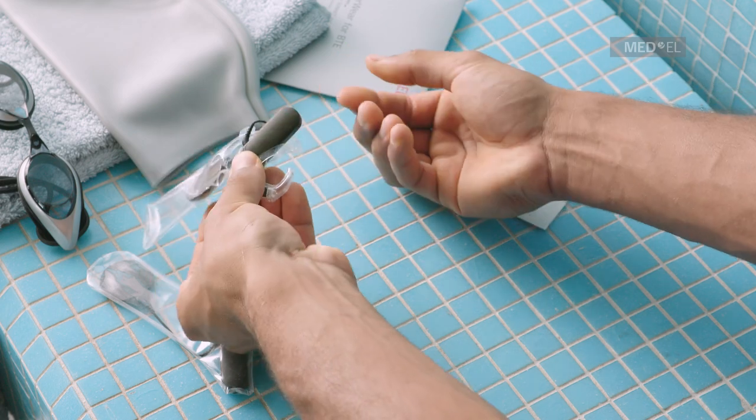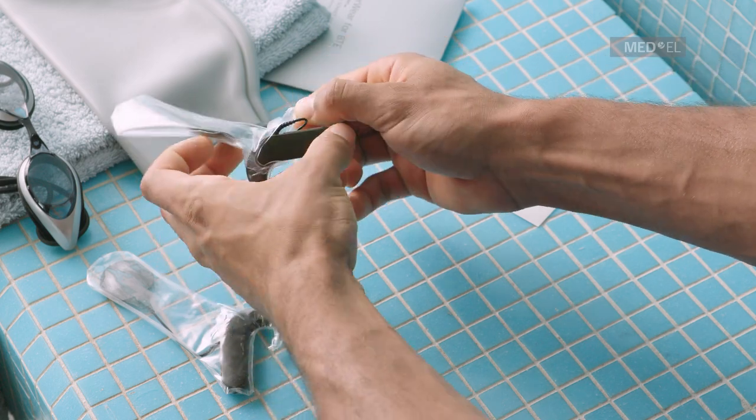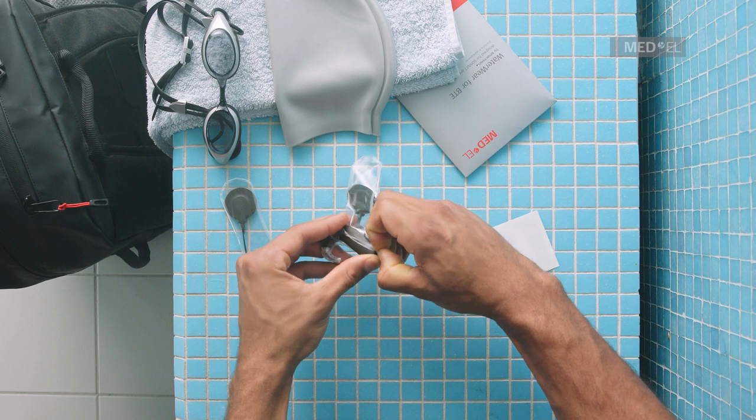Hold the control unit with one hand and use the other hand to pull the Waterwear cover over the battery pack. It will be a tight fit, so there will be some tension.